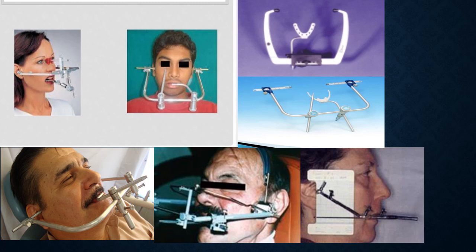And this is the complicated one, on the right side of the screen. These two figures are the kinematic facebow. It is attached to the lower jaw, and it is not used in an edentulous patient, mostly in dentulous patients. It has a clutch attached to the lower, and the true hinge axis location is found by asking the patient to open and close the mandible until the stylus rotates without translation, to locate the true hinge axis of the mandible. This is just for your knowledge.